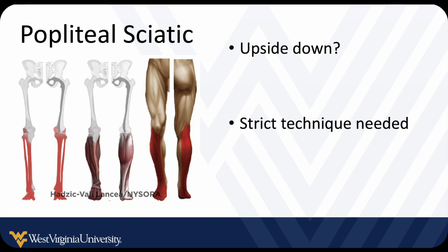One thing that's important is a lot of these patients, I'm going to show you what it looks like on the screen and how you do it. Many of these patients come in, they're lying on the stretcher. Hopefully they've got their ankle elevated to reduce some of the swelling. They probably aren't going to love you having them flip over in the bed and wobble their ankle around. So there's a couple different ways to do this. You may turn them on their side and approach this kind of superior to inferior, or most of the time when I've done this, I just have their ankle propped up and the probe is inverted underneath in the popliteal fossa, and I'm doing the injection kind of upside down.